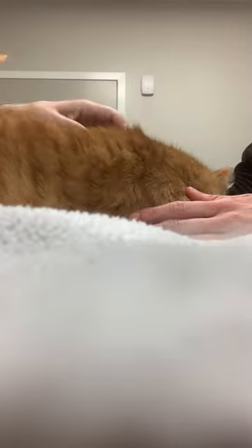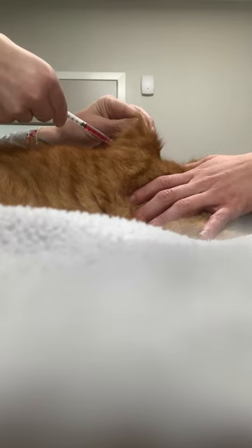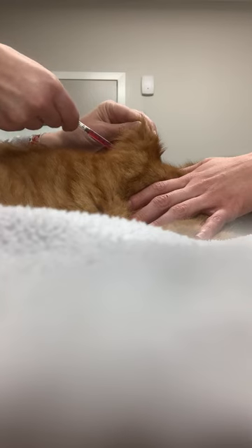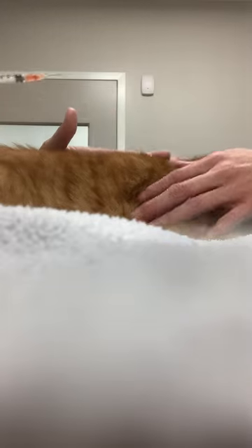I'm going to take the cap off. Good boy buddy. Right into my tent. I'm not getting any air back — see how the plunger goes right back to its normal position? That means I'm in the right area, and then you can go ahead and inject. Good job buddy.